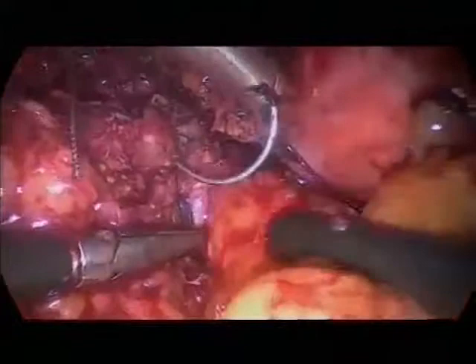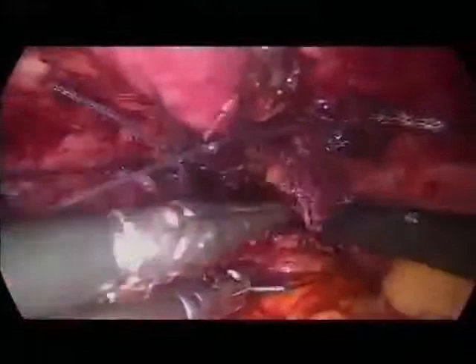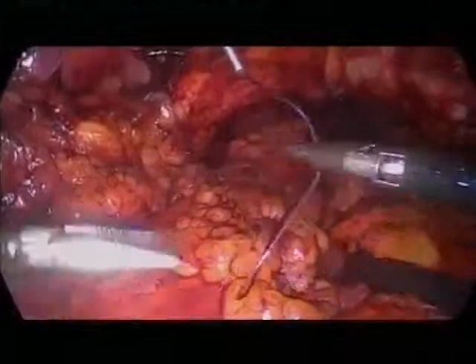You see, this is the bladder neck. Can you see that? This bladder neck, and now we see it. We stitch through the urethra. It's here. But this is totally different from the concept of Eshtevari, who is reconstructing the dorsal vein complex at this part. Have you been influenced by the paper of Eshtevari?